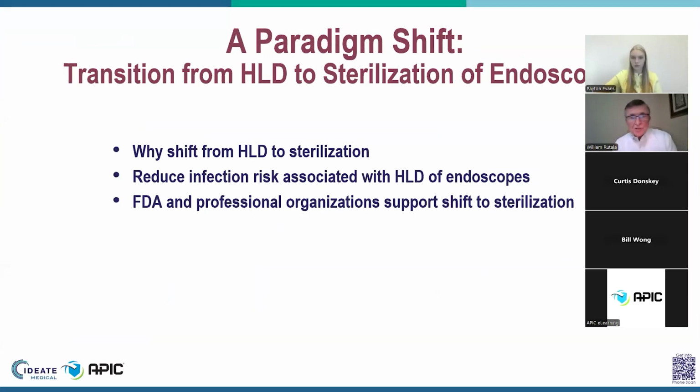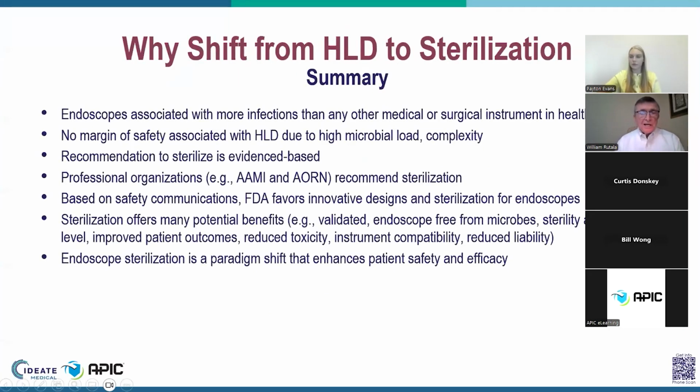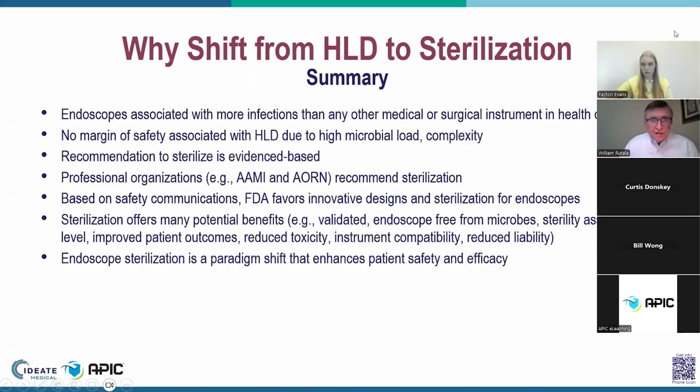So the last slide is a real quick summary. The last slide talks about endoscopes associated with more infections than any other medical or surgical device in healthcare. We, of course, have no margin of safety associated with high-level disinfection due to the high microbial load, the complexity, and of course, the bioburden on those instruments.